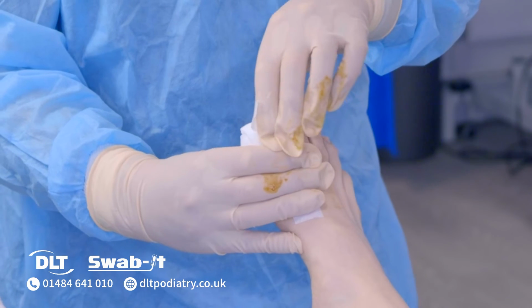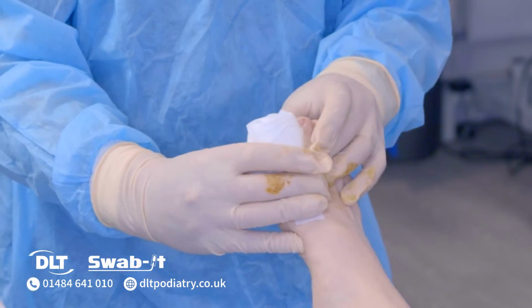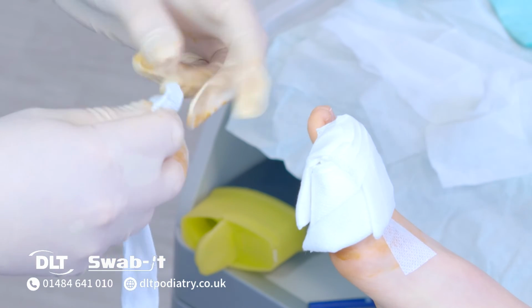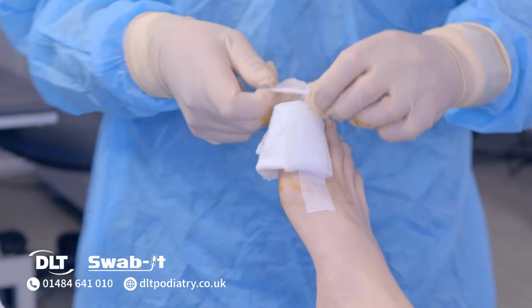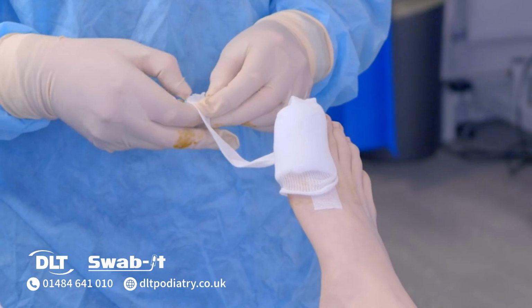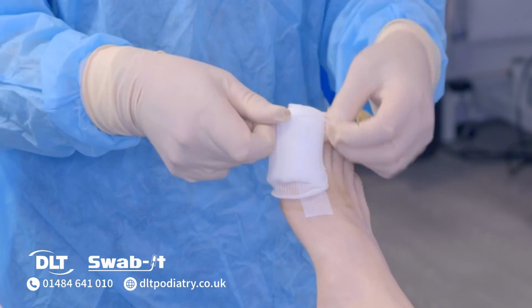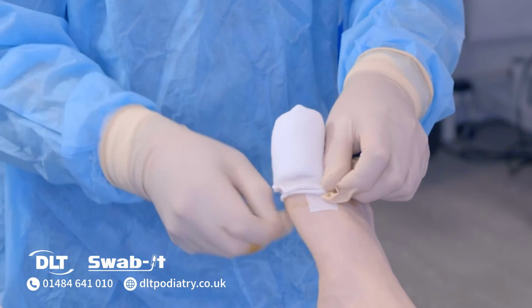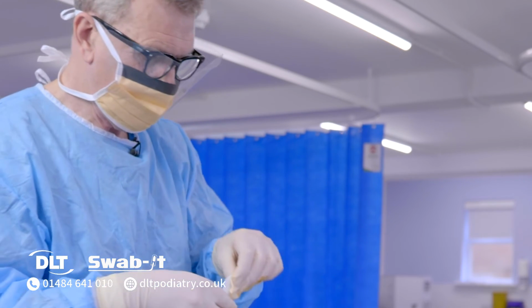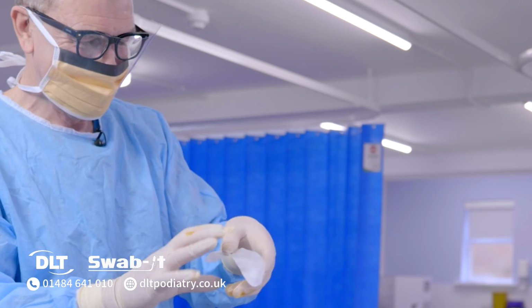So we've given this patient advice on post-operative care during the consultation. We'll go through it with him again. I usually use 2 bases as well, just in case. Oh, you've got them there. Well done. You're the same then.